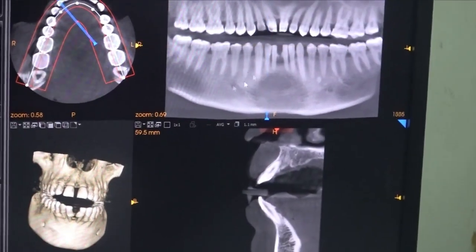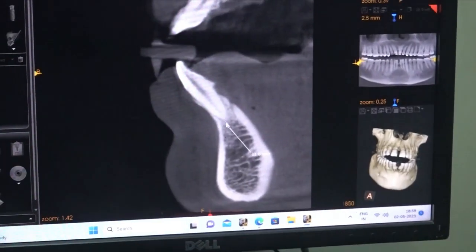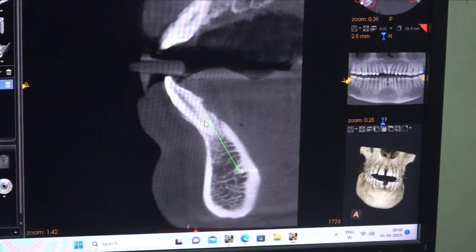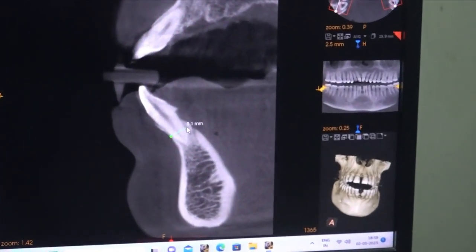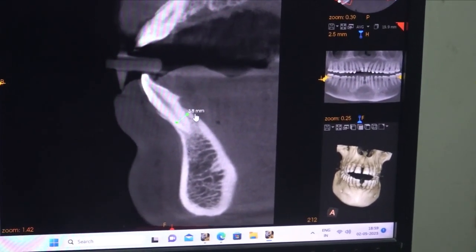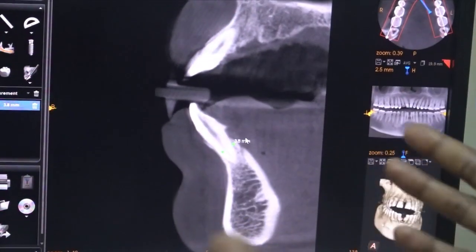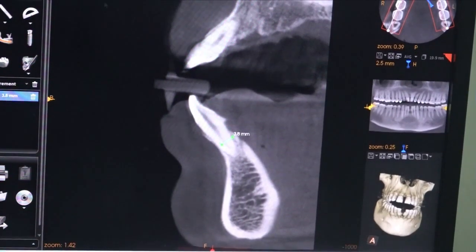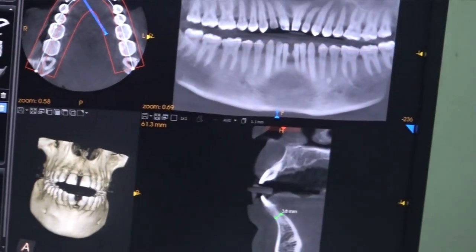So what is the diameter and length? Okay, here we can put a long implant also, around 16, 18. There are three diameters we are using now. One is 3.75 and one is 4.2. So if you put 4.2, the implant will be very wide. Crestally there may be little bone left outside the implant. So it is better to place 3.75, 16 or 18. Okay.